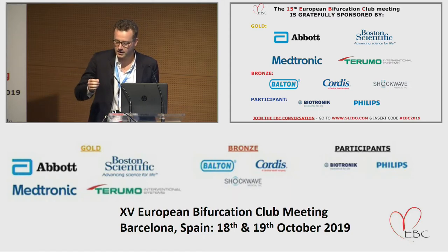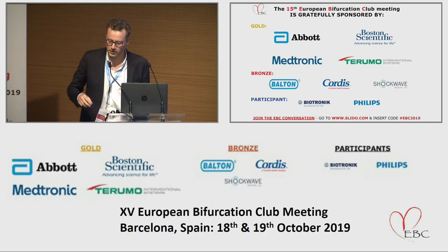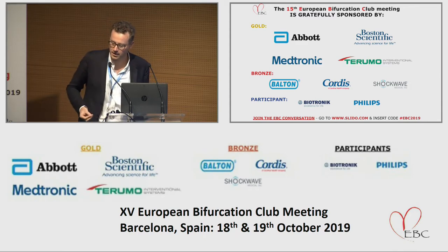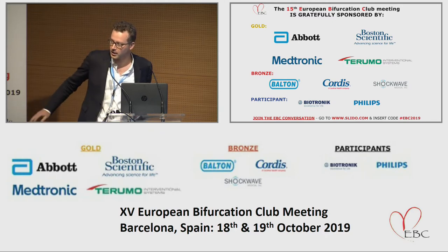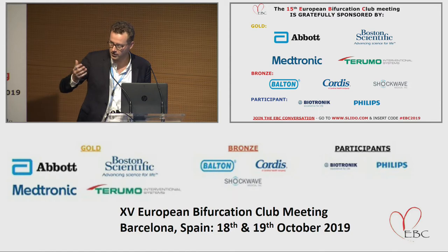That's why, I have no time to discuss that, but in the protocol, we advise a compliant balloon, because due to the mechanical properties of the balloon, you have a range of diameter at increasing pressure greater than a non-compliant balloon. You have a range around 20% of diameter compared to less than 10% with non-compliant balloon. So in left main, it's difficult to get a compliant balloon at the good diameter, so it's okay to use a non-compliant balloon. But the real advice is to use a compliant balloon for all lesions as you can.